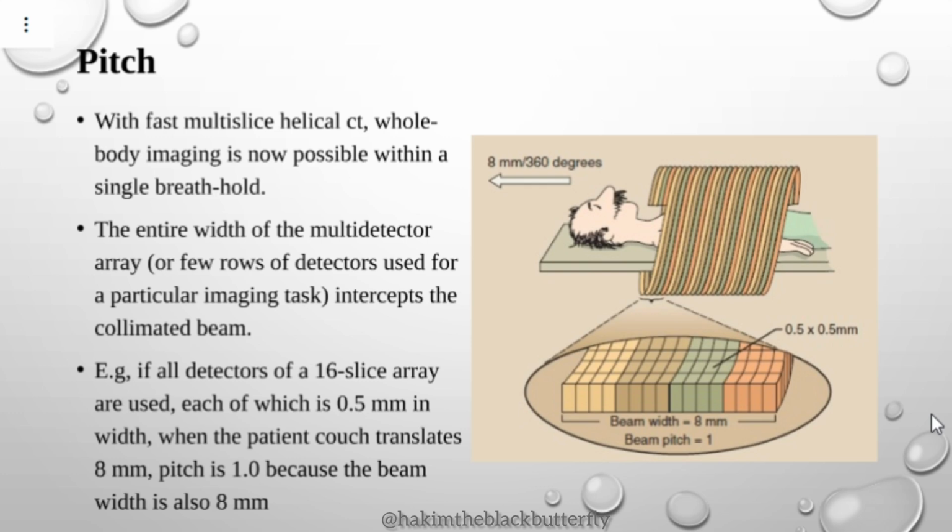With fast multi-slice helical CT, whole body imaging is now possible within a single breath hold. That is what I've been talking about. I don't know whether you understand when I say multi-slice. Do you understand that?